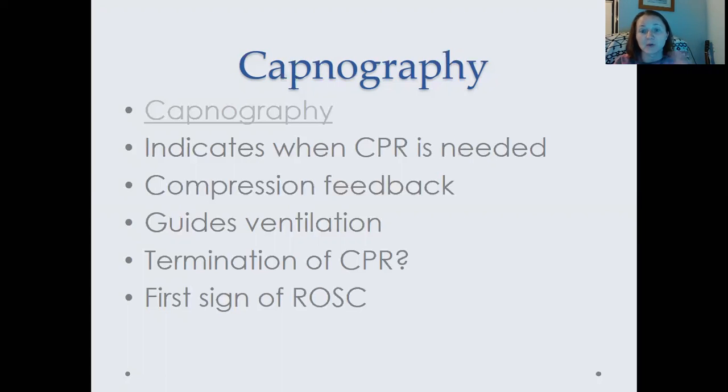If you're expecting a respiratory cause, remember hypoxia was one of our causes for cardiac arrest. So if you're watching somebody's breathing and you think there may be cause for concern, that capnography waveform will disappear before you see the pulse oximetry drop. If hypoxia is the reason for cardiac arrest, that would be the order in which you would see the drop.